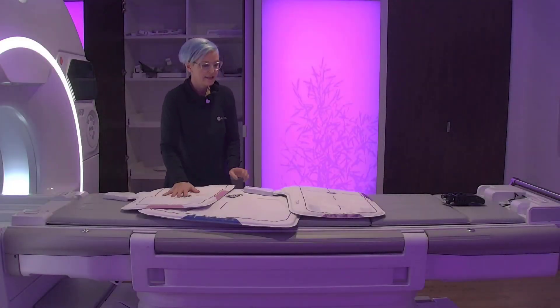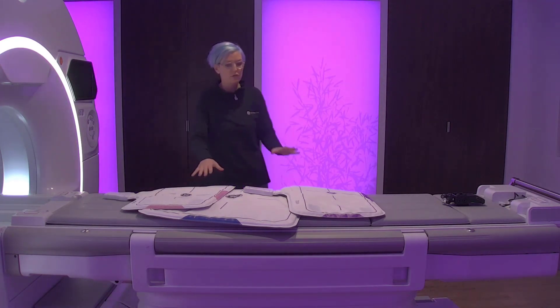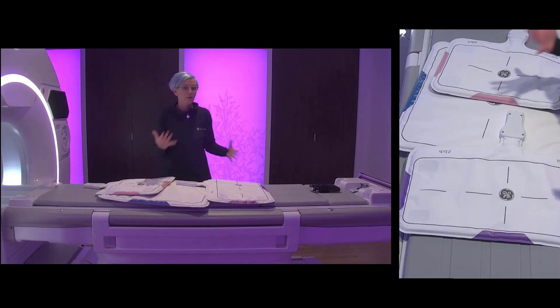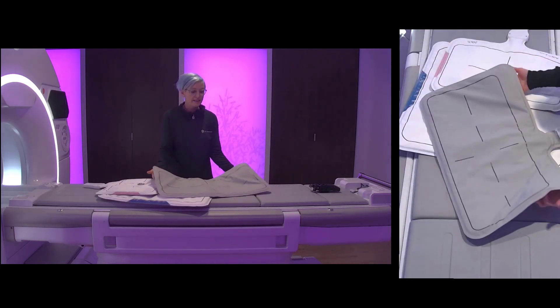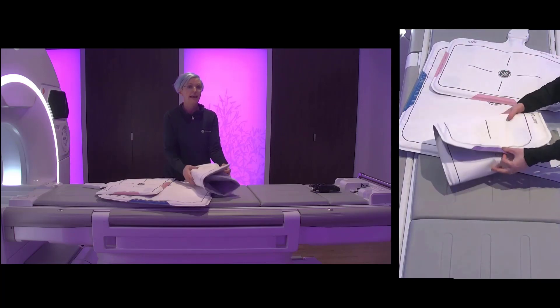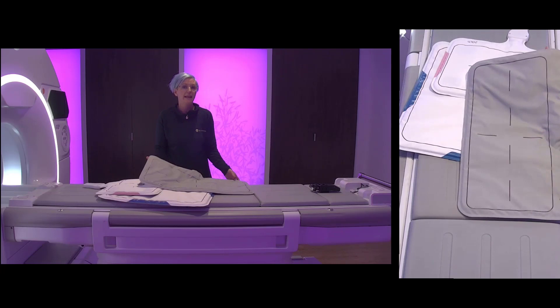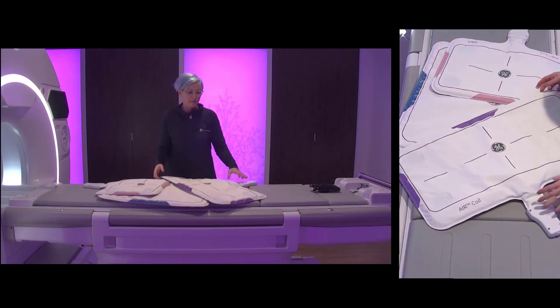We have all the different sizes of air coils lined up. We have one large one and two smaller ones available. These come with a lot of benefits for the technologist and also for your patient. For the technologist, it's easy to wrap them around any anatomy you might have to scan. You don't have to think about overlaps and combinations — anything is allowed and always gives good image quality.